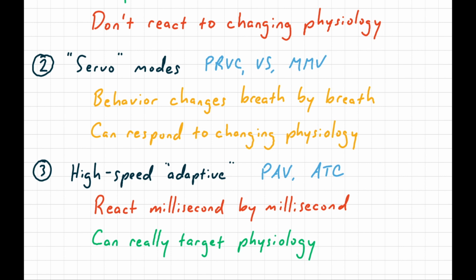For example, I can't claim to know exactly what would happen if you had a patient on proportional assist ventilation and then started giving them aggressive percussive chest physical therapy, but based on the underlying computations, the ventilator might start increasing and decreasing the circuit pressure rapidly. So with that framework, we'll conclude our whirlwind tour of the ventilator modes.